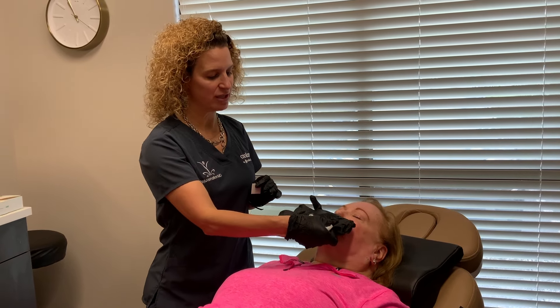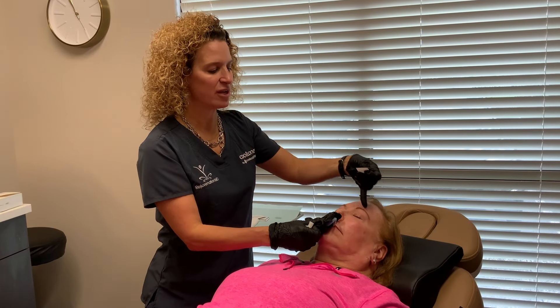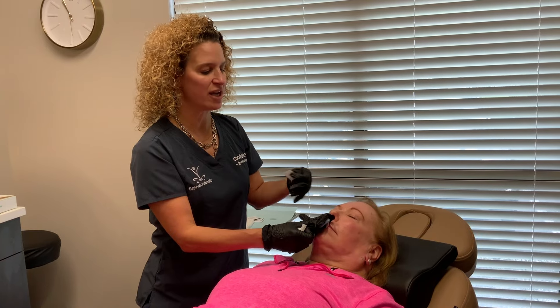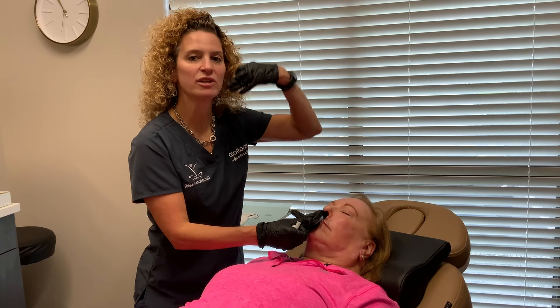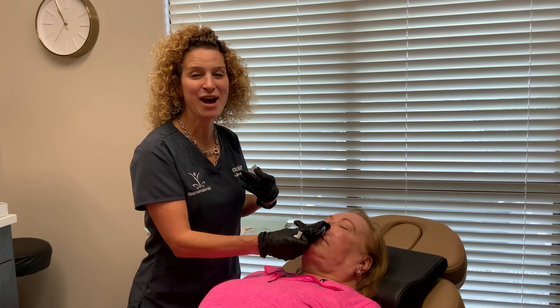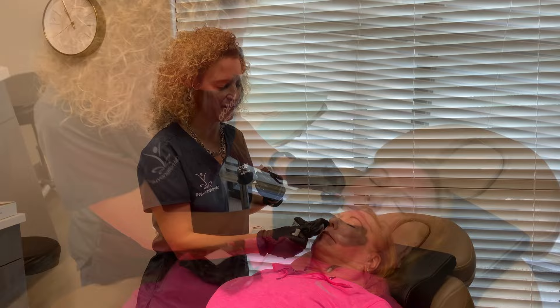We would like to make collagen everywhere. You can put them anywhere — above or around the eyebrow to help lift it, in the forehead to help lift, in the cheeks to help lift, or the neck to lift, or even the breasts and abdomen to lift. So there are lots of options for PDO threads.